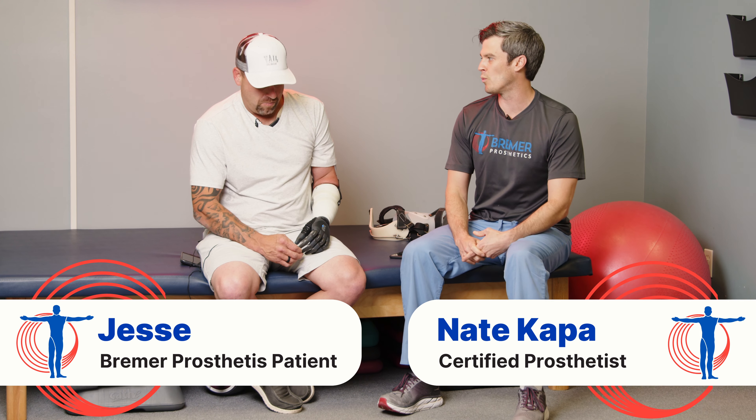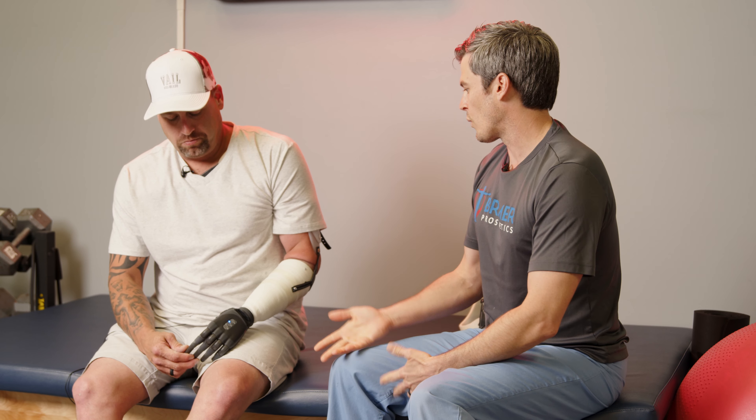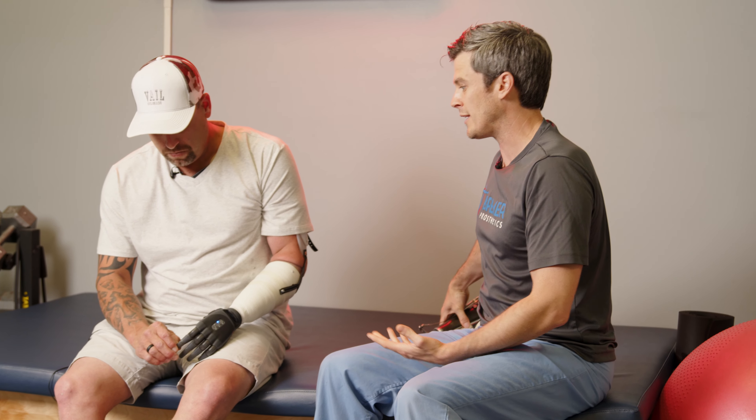I met Jesse about a year ago, maybe a little bit more than a year ago. He'd used a prosthesis for a long time. He had a good one and he knew what a good one was, which makes a big difference. So we built him a body powered prosthesis with a traditional hook because he's a heavy duty guy.